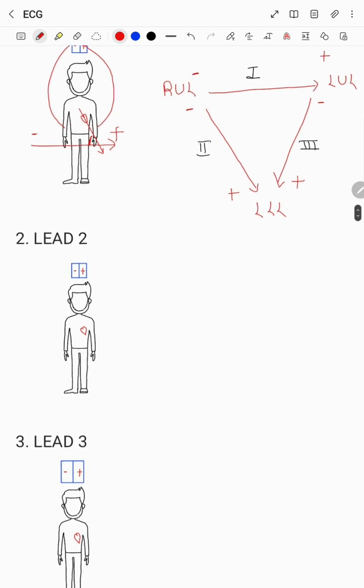In lead 2, the negative is attached to the right upper limb and the positive is attached to the left lower limb. This is negative, this is positive. This would be the direction of current and this is the direction of impulse. Both are in same direction. So again, P and QRS will be seen as positive.